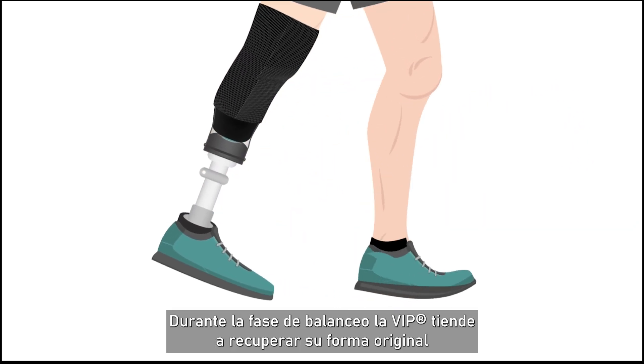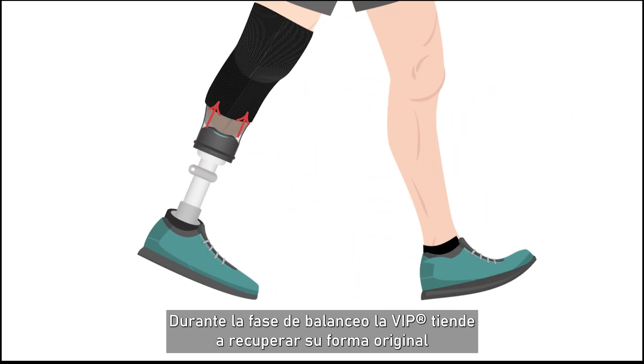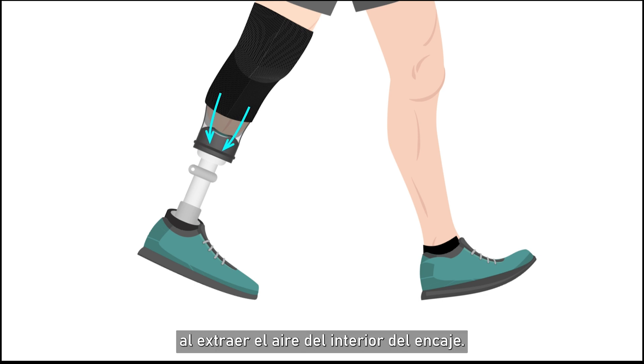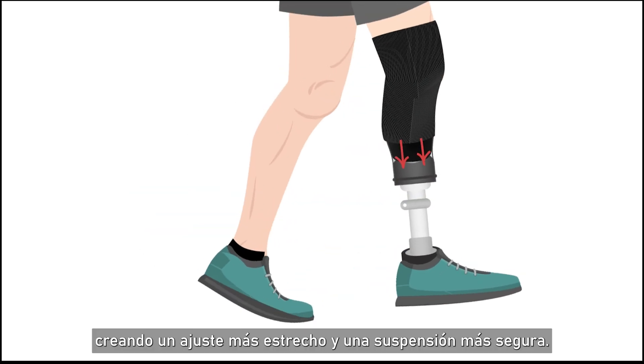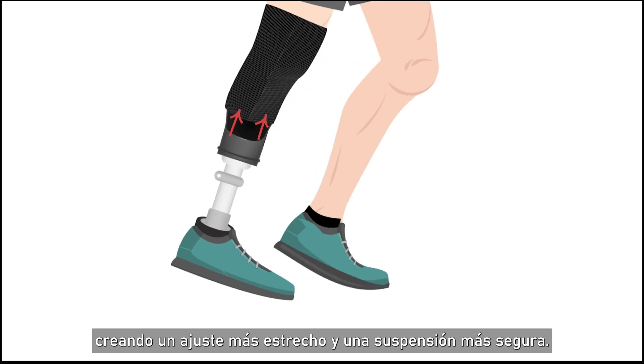During the swing phase, the VIP tends to return to its original shape by drawing the air out from the interior of the socket. The residual limb is pushed up against the socket walls, creating a more intimate fit and a more secure suspension.